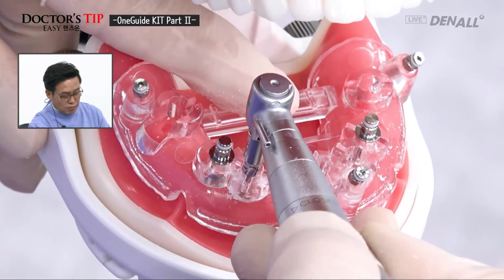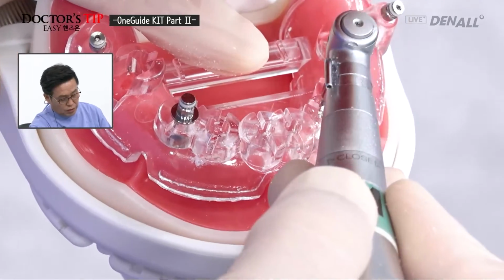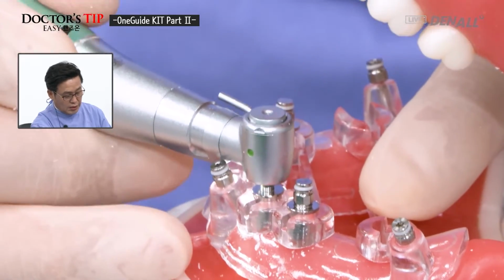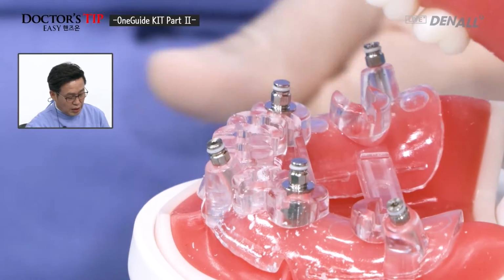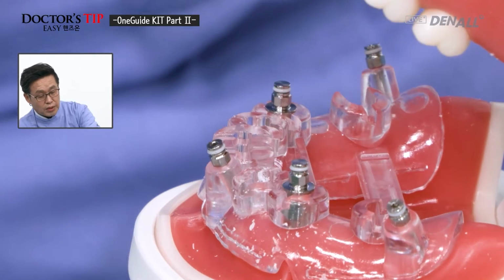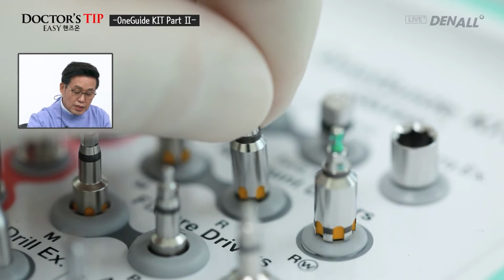Again, I'm going to drill full length on both canines. I'm going to drill full length on this side as well. Drilling is complete, and I'm going to place the implant now. No mount driver, regular size is selected.